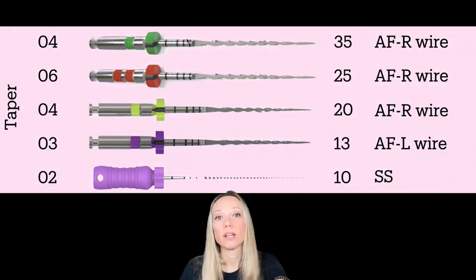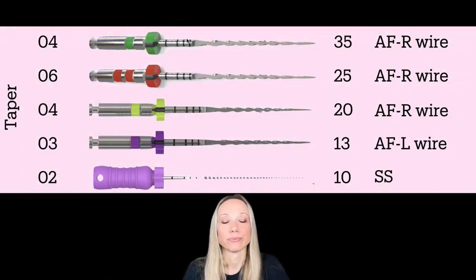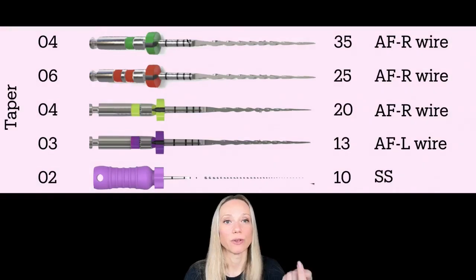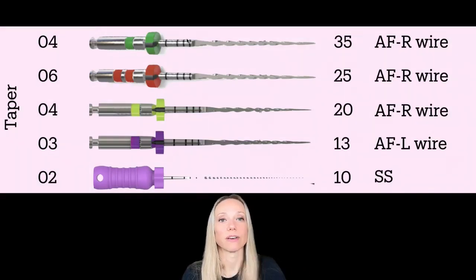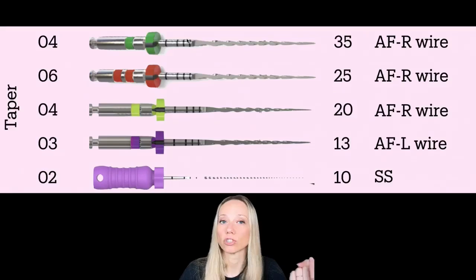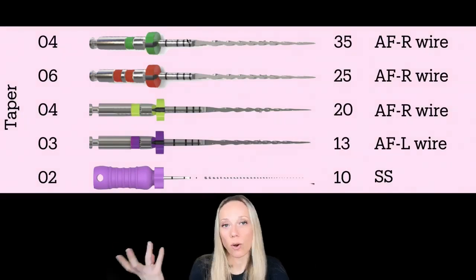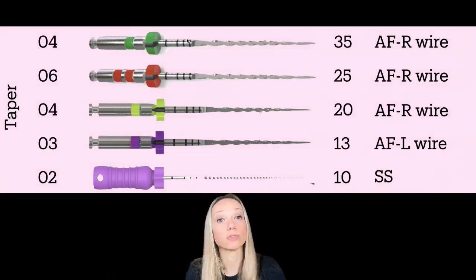And then, what if we need even larger files in a tip? We have a 35, but in this case the taper is reduced because I don't need a 3506 file. In most of the cases, the 3504 is more than enough. So I save coronal structure while going to enlarge the apex to the size that I need.